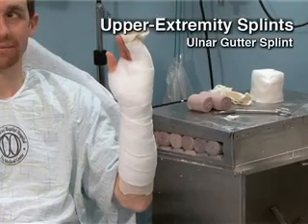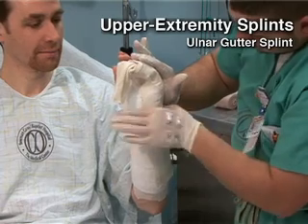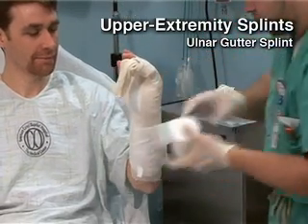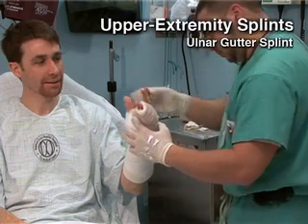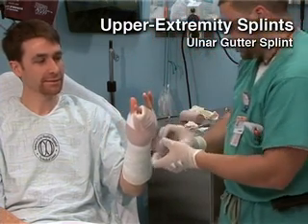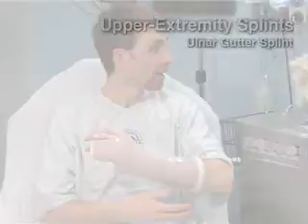Ulnar gutter splints are designed to immobilize fractures along the ulnar aspect of the hand, including injuries to the 4th and 5th phalanges and metacarpals. This splint extends from the distal interphalangeal joint of the little finger to the proximal forearm. Place the forearm in a neutral position with the wrist in 20 degrees of extension. The metacarpophalangeal joints should be flexed at 50 degrees, with the proximal and distal interphalangeal joints in slight flexion.